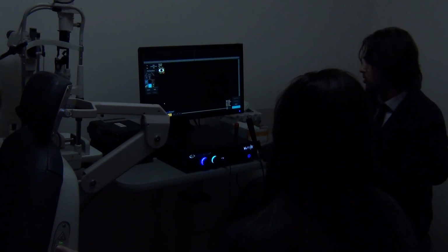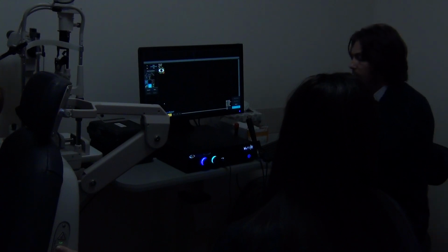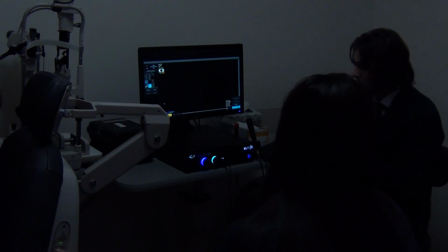And the same way you can do like your Quantel unit, right, which you used to clean the probe. Soak probably in alcohol the transducer. Is that what you've done in the past? Yeah, so same way. There's like no changes. The only suggestion would be never wipe off the transducer, because it's gold plated, and if you put any scratches, that will interfere with the image in the future. So we would like to avoid that.